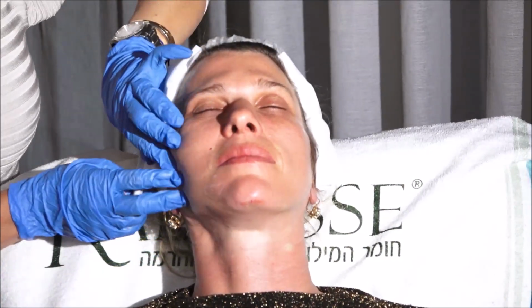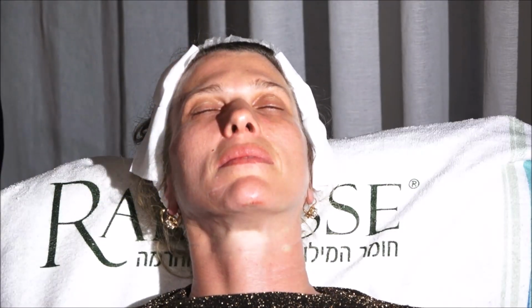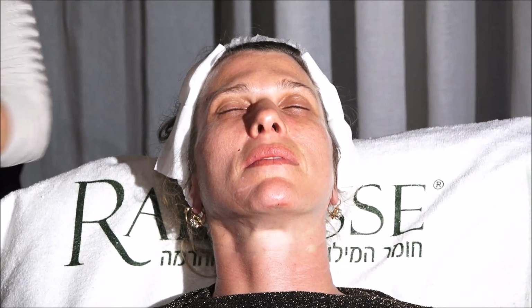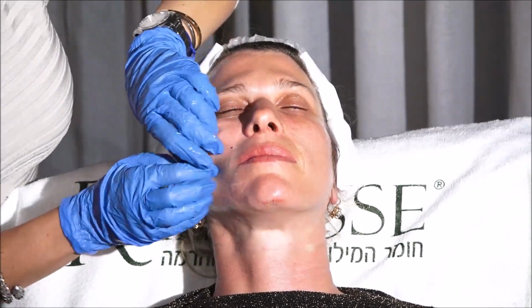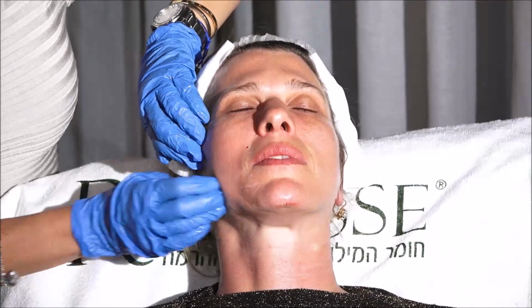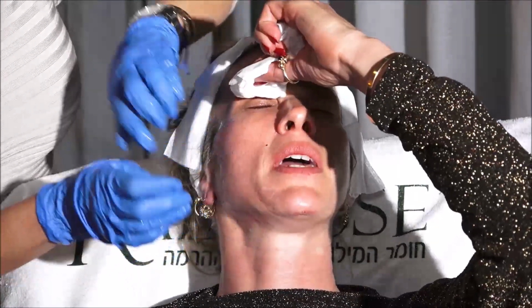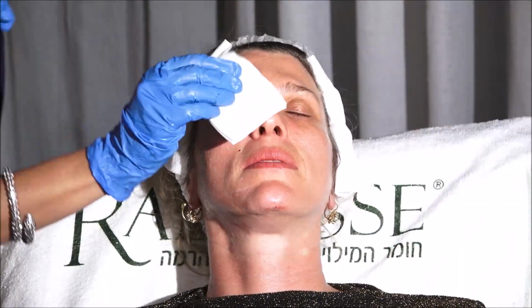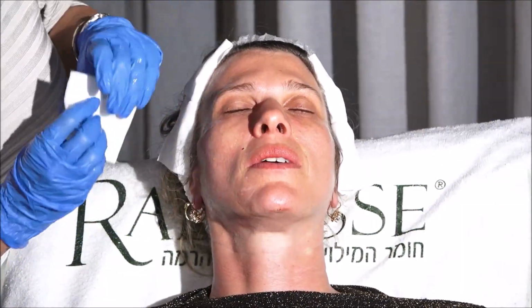I normally massage, as I said, for the first 5 minutes. So let's massage the face a little bit to spread the product as much as we can. Just a minute, it is in my eye. Wait a minute. Thank you. Okay.